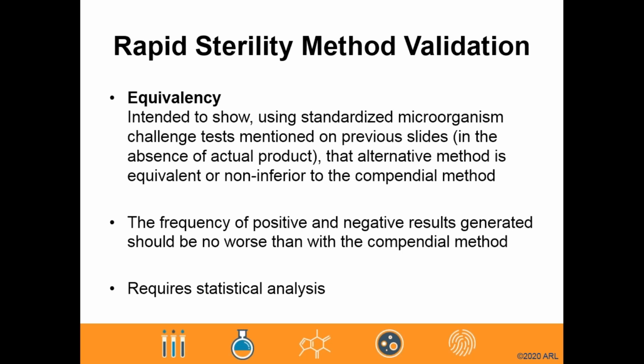Similarly, the FDA Guidance for Industry document Analytical Procedures and Method Validation, Chemistry, Manufacturing, and Controls Documentation states that a validated alternative procedure must be shown to have performance equal to or better than the regulatory procedure. When comparing two test procedures to show equivalence, statistical evidence is assembled to demonstrate non-inferiority or statistical non-inferiority. For example, with sterility testing, equivalence may be shown if there is no statistical significant difference between the two groups of results generated when performing testing with both the compendial and alternative methods.